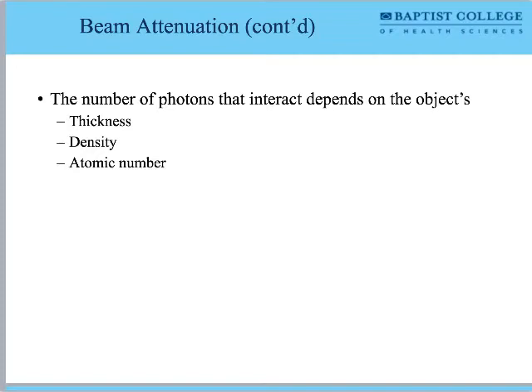It's H2O. They are in different physical states. One's a solid, one's a liquid. That's what I mean by density. The ice is more dense. It would hurt more. So the ice would show up whiter on the picture than the water because of its density.